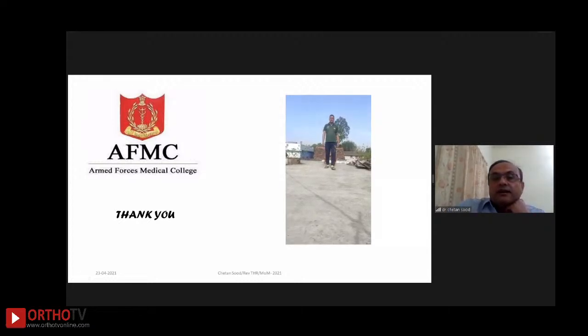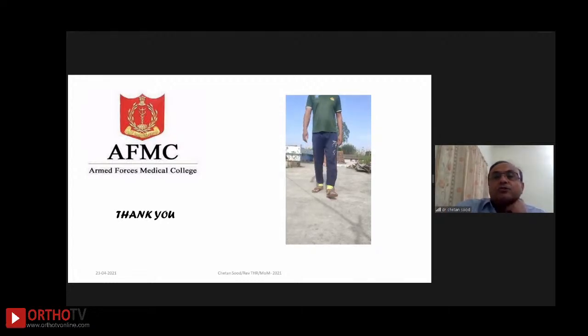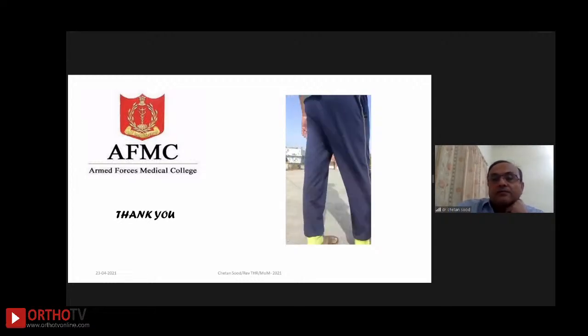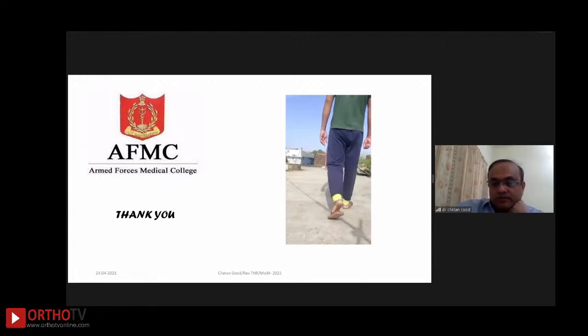Both sides done. And I'm very happy that he's got a similar leg length. And there's no rotation, which I expected, I expected him to have an external rotational kind of problem, but he's done so well so far.